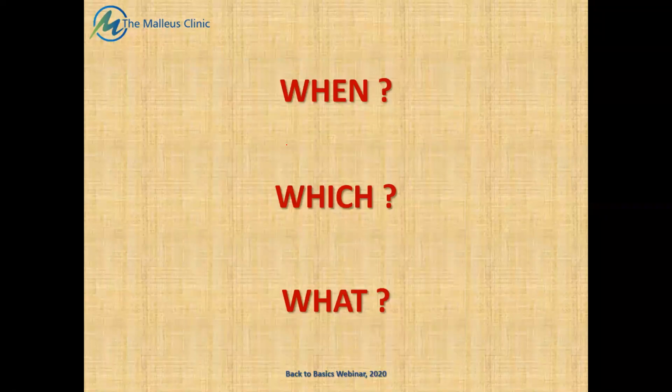So finally, where we started off from: when to do, which to do, what to do. I hope by now you know why I titled my presentation as what to look for and then when to do, because it is your clinical acumen that decides, A, when it is that you want to image the patient. I'm sure all of you would agree that once you know what you are suspecting, that is when you decide whether you need to image.